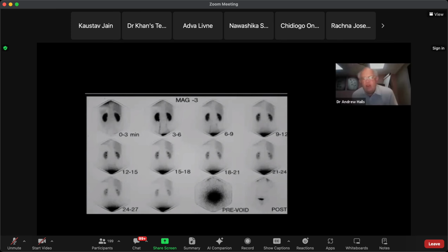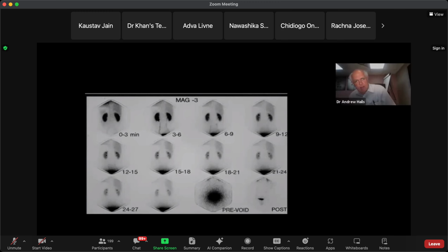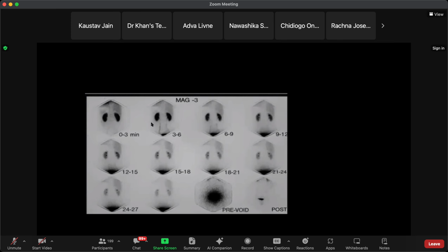Now, admittedly, you might have left and right marked on something, but when you're doing kidneys, because they lie posteriorly, you'll have the gamma camera behind the person. So unlike most radiology, where the left is on the right side, in a MAG3 renogram, usually the left is actually on the left side. Okay, so yeah, that will be the left kidney, quite right.